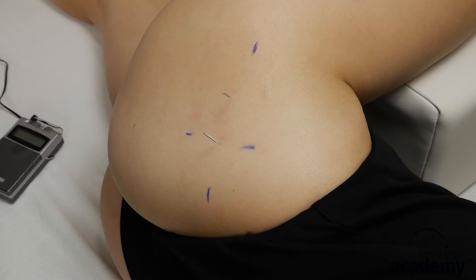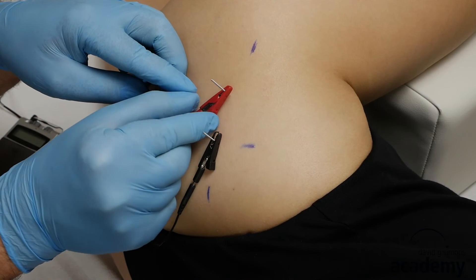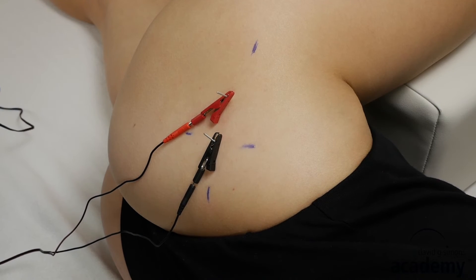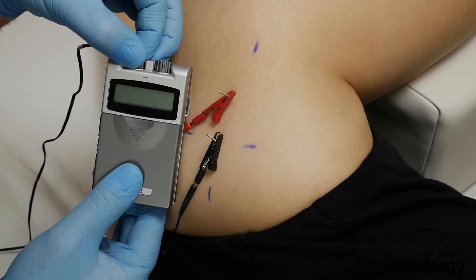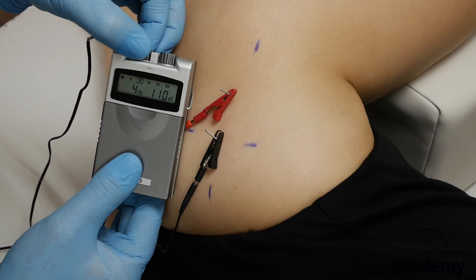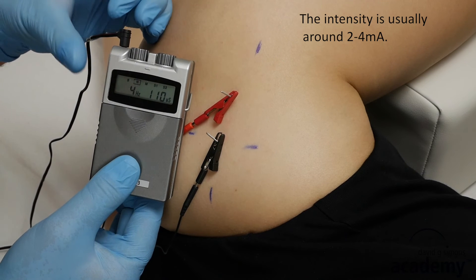Now attach the two electrodes on the needles. Increase the intensity until the patient starts to feel the pulsation — it should not be painful. The intensity is usually around two to four milliamps.